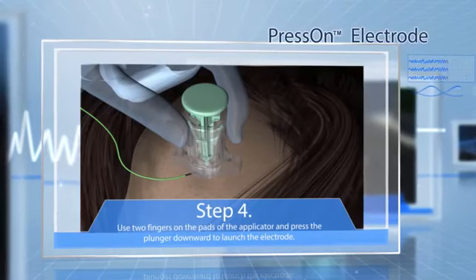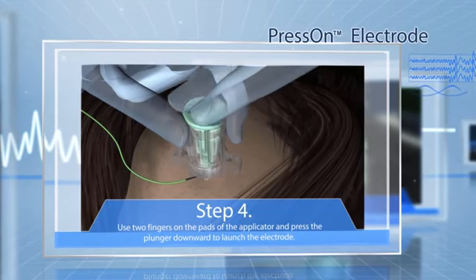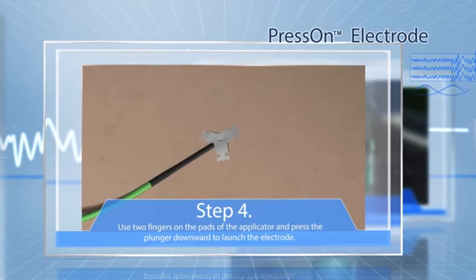Step 4: Use two fingers on the pads of the applicator and firmly press the plunger downward to launch the electrode. When the plunger is completely depressed, the electrode is deployed.